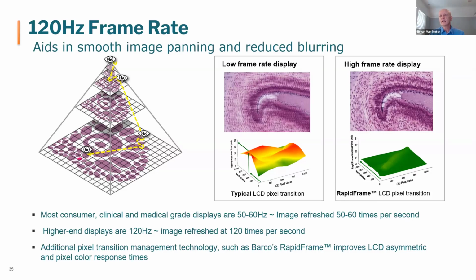And so there is technology involved in displays that are medical grade that says, I'm going to change from one color to the next while I'm doing this frame change. There's undershooting and overshooting that happens. Without technology in there to manage that pixel transition by color, it doesn't look so well, or it has an effect on, more effect on the blurring.